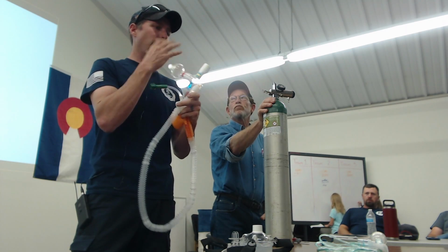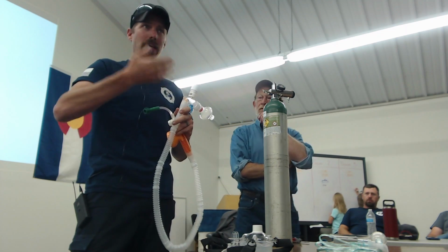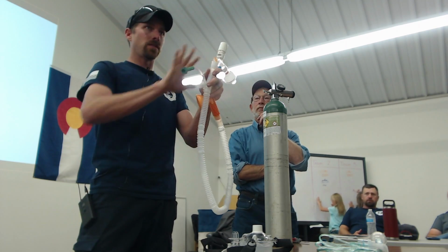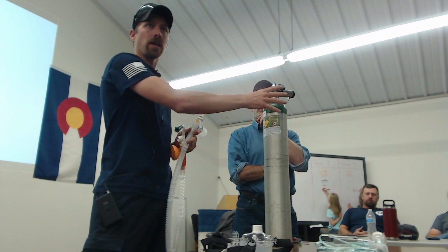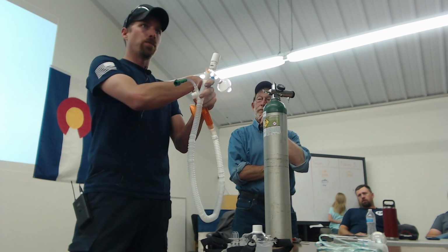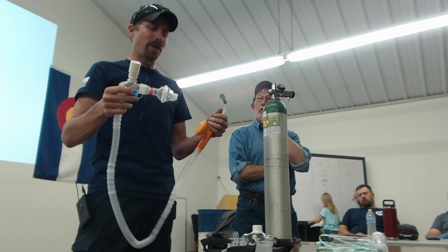You don't want the patient to be locked into this mask and then all of a sudden run out of air and not have any air to breathe. So while this device is in operation, the pressure will close that valve and keep this device sealed from the outside air. If for some reason you run out of house oxygen or the bottle and this device shuts down, that valve would fall open and allow them to breathe atmospheric air in so that you're not asphyxiating your patient.